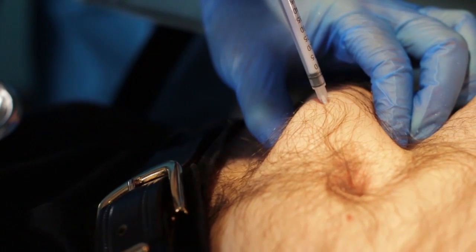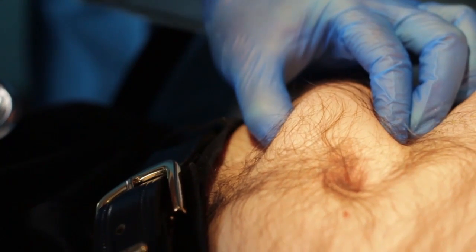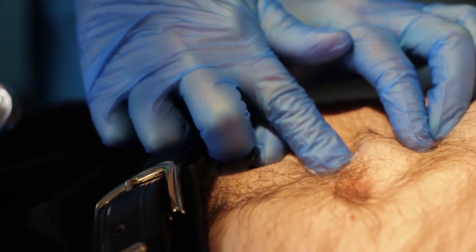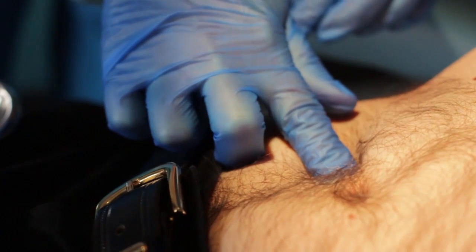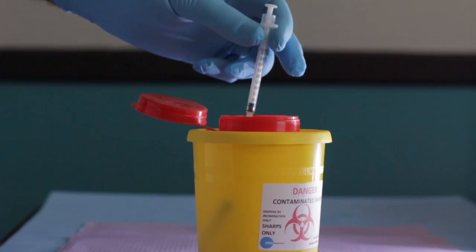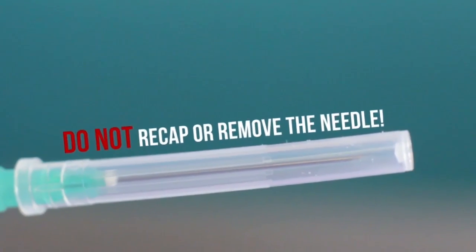Remove the needle from the skin and release the skin. Press a piece of cotton wool or gauze lightly over the injection site for a couple of seconds. This is optional. Do not massage the injection site. Discard the used syringe and needle in the sharps waste receiver. Do not recap or remove the needle.